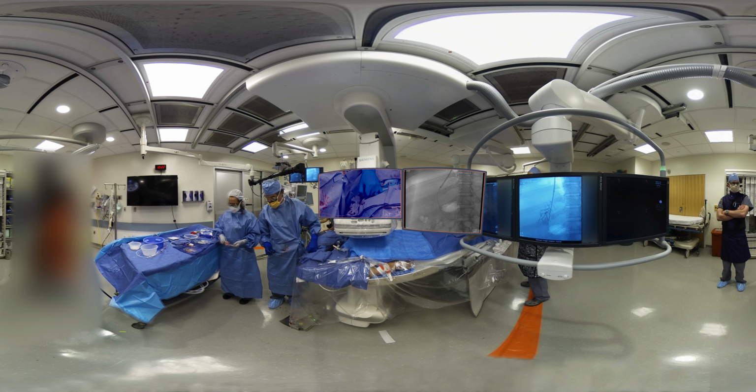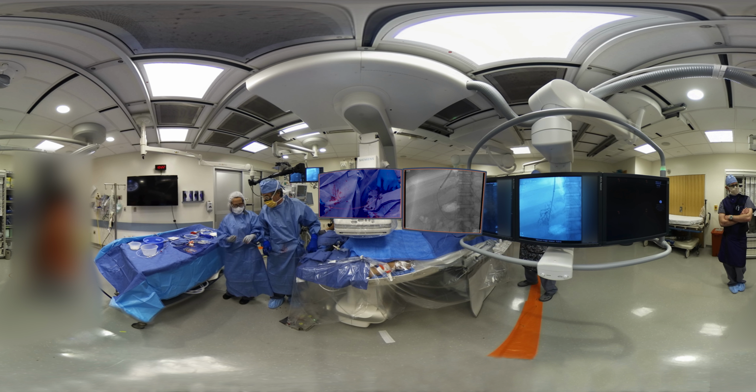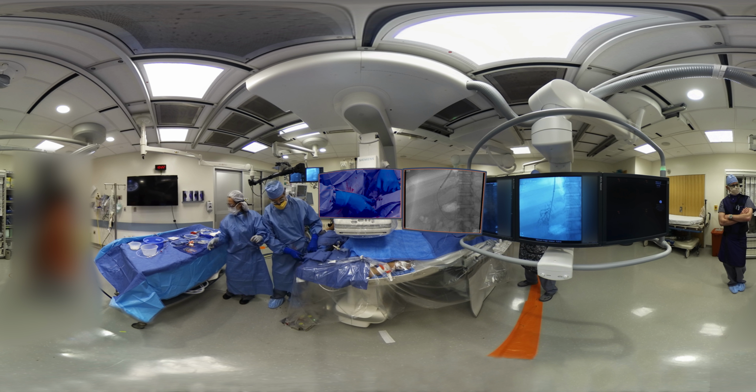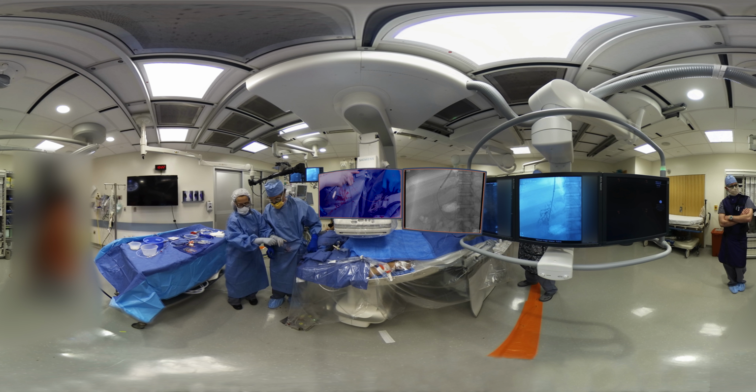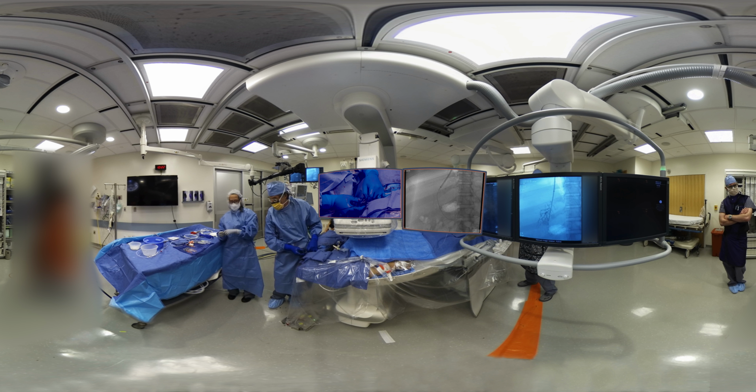My favorite wires for entry are a hydrophilic wire with a long tapered segment. So that comes through various brands, be they black or white. So at this point, an 80 or 100 centimeter long catheter is well suited.